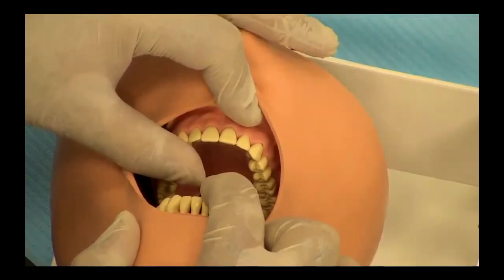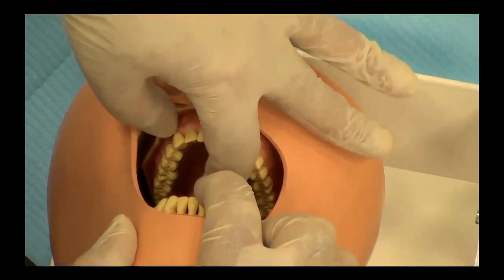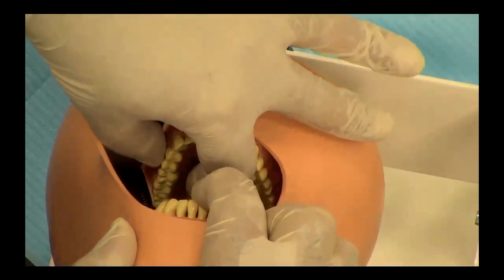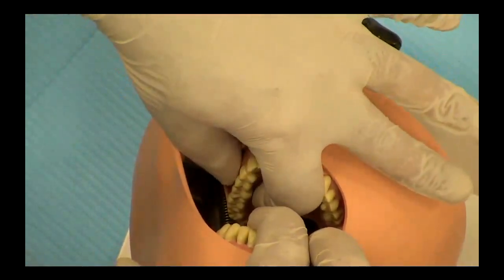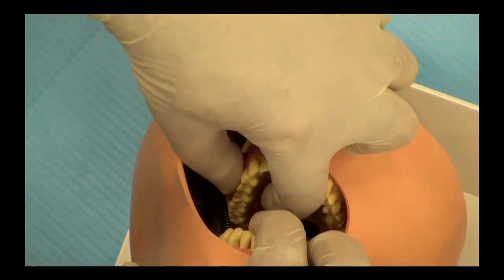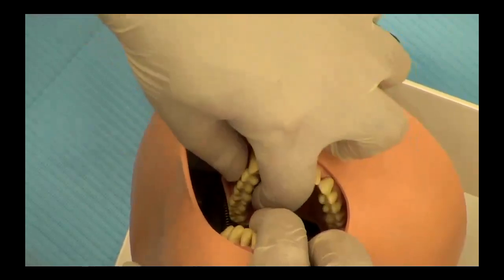For the maxillary right posterior region, you will have to bring your forefinger on the palate and the thumb on the buccal side. That's the position you will need to adopt for the maxillary right posterior area, and make sure the other fingers are closed, otherwise they will rest on the patient's face like a spider, which obviously they're not going to like.